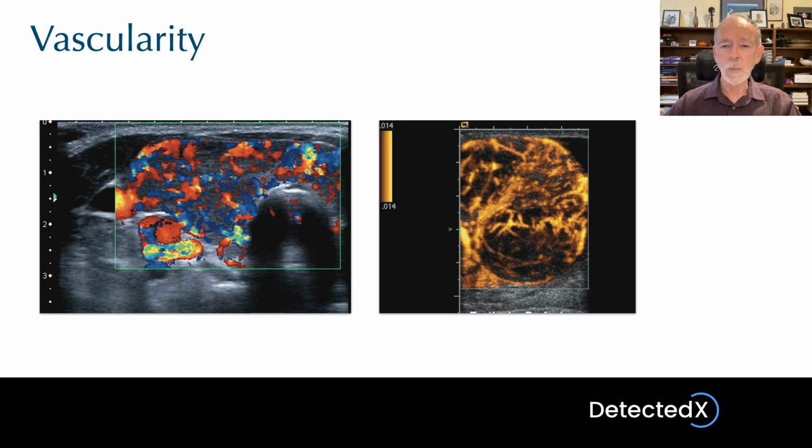So we're simply looking at the presence of flow. We're ignoring direction and Doppler shift and simply saying, whereabouts is there flowing blood? You'll see how much easier this is to interpret, how much more meaningful this display is. So this power mode Colour Doppler is very useful in specific applications such as this.